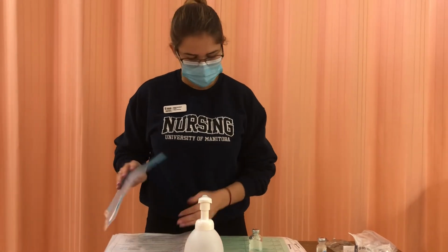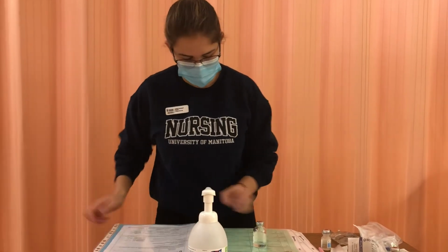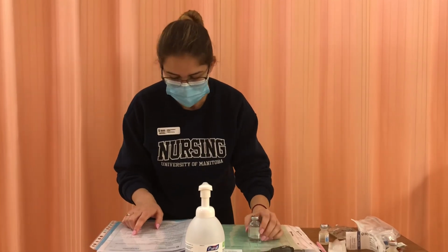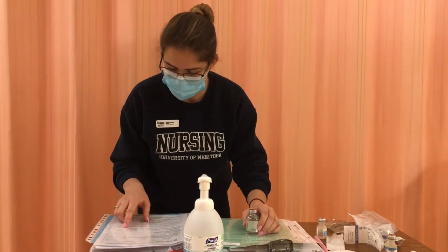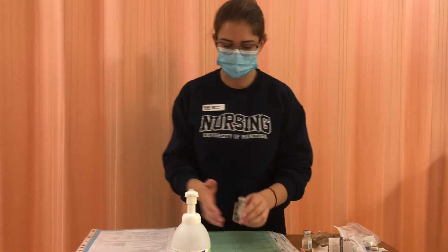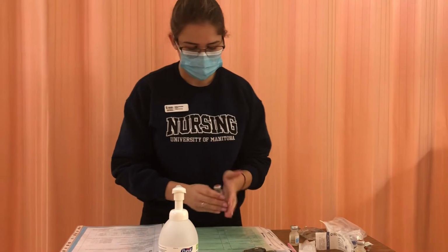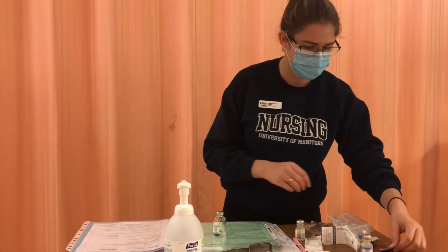container. So now I'm just going to recheck my reconstitution. So I used 6.8 mLs of sterile water in my syringe to reconstitute. I have now a final concentration of 250 milligrams per ml. So I'm gently going to roll it to mix my med. So that means I'm going to have to draw up 3 mLs to get the 750 milligram dose.